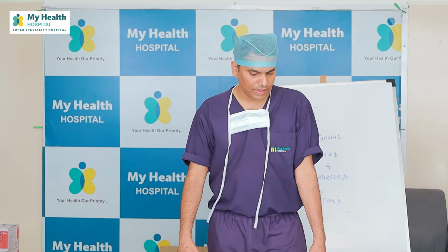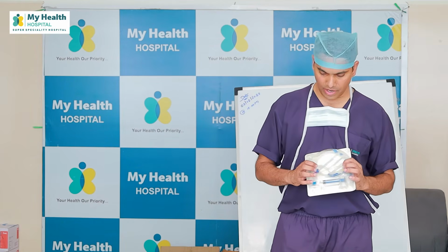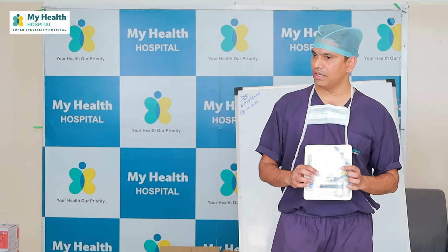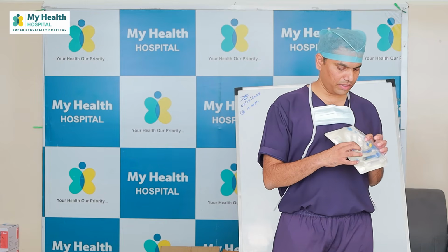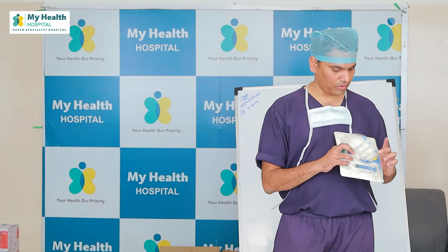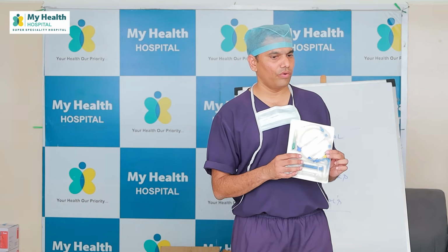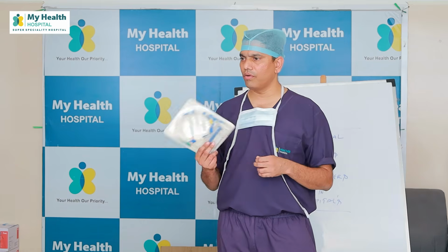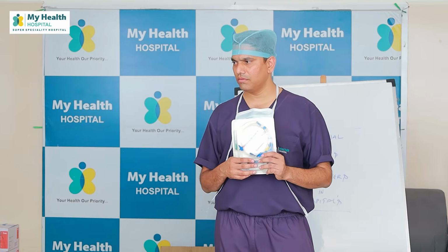Okay, that's it. Next, this is a central venous line. You have three lumens where it is clearly seen. It has three ports. So these three things, how do you use them? What else do you have? Triple lumen, a central line. How many other lumens do we have? Single lumen central can be put like this.